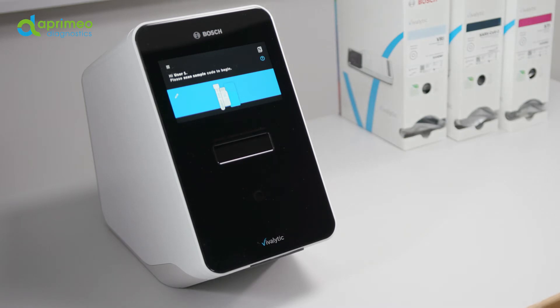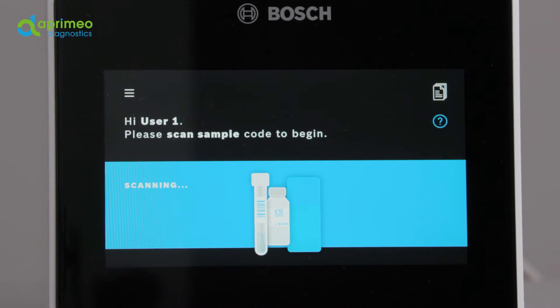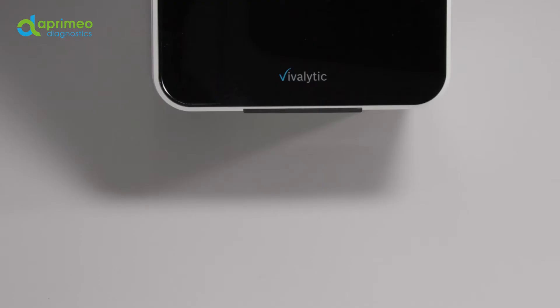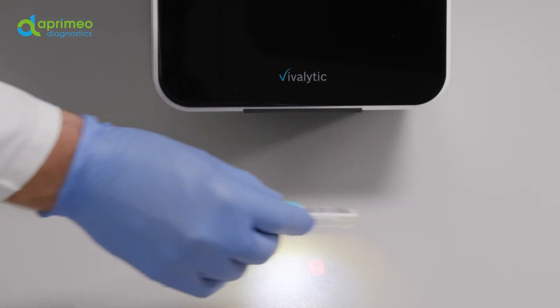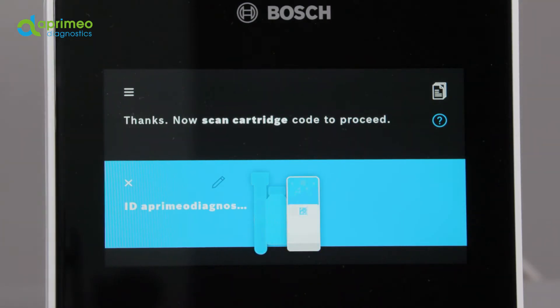Before opening the cartridge package, make sure that the device is ready for a test. In order to start the test, place the sample barcode around 10 cm underneath the scanner. A white light with a red dot shows that scanning is underway. Then the sample data are shown on the display. In case your analyzer is connected to a general hospital or laboratory information system, data are matched automatically. Alternatively, you can enter the data manually via the pencil icon.